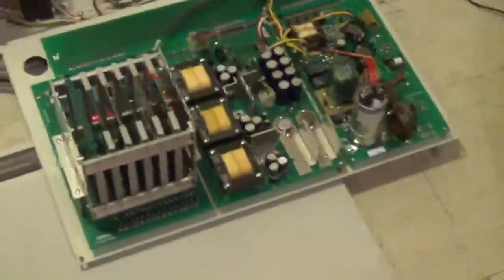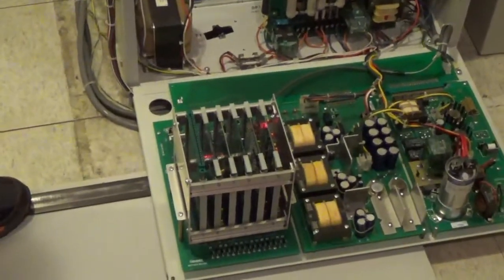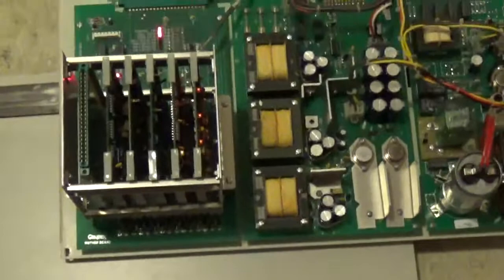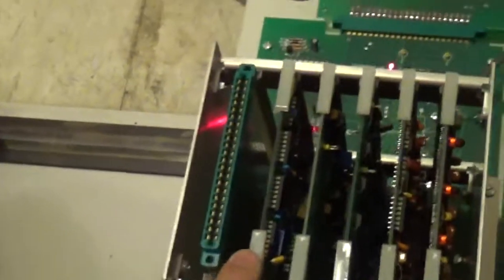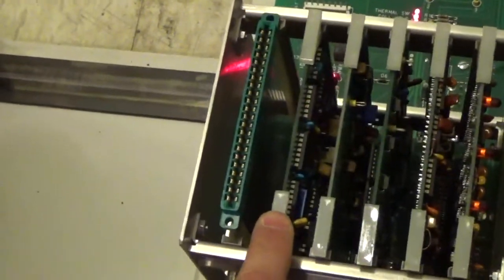All right, so we're going to do a little calibration video on the GX525 Gendex Dell generator. We've got the front cover flipped open already. Let's go over some of the components. The MA rotor board, which is, where are we at? Right here. Yep, that's the board we're going to be interested in. It has to go up on the extender. Okay? Got that? We know that.